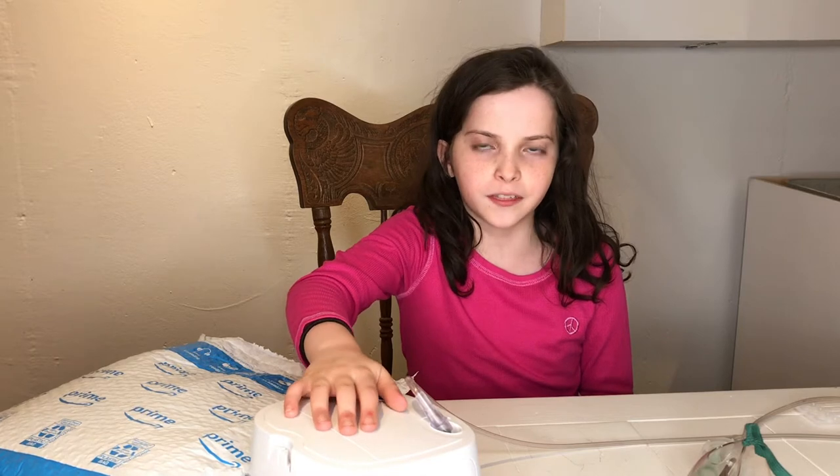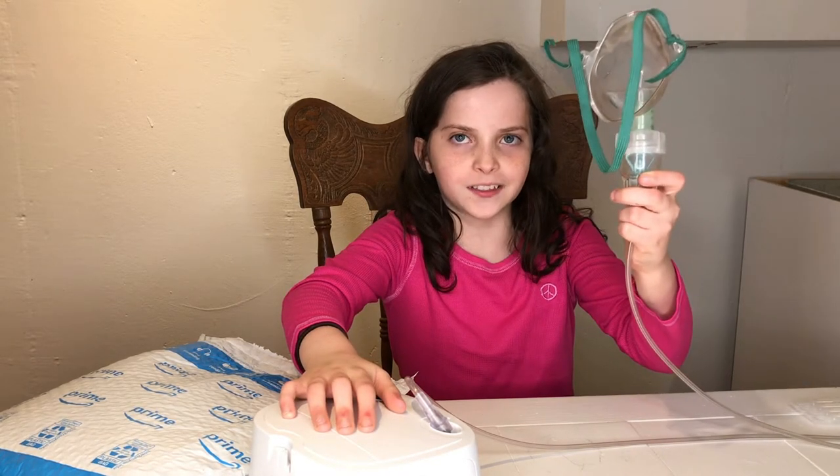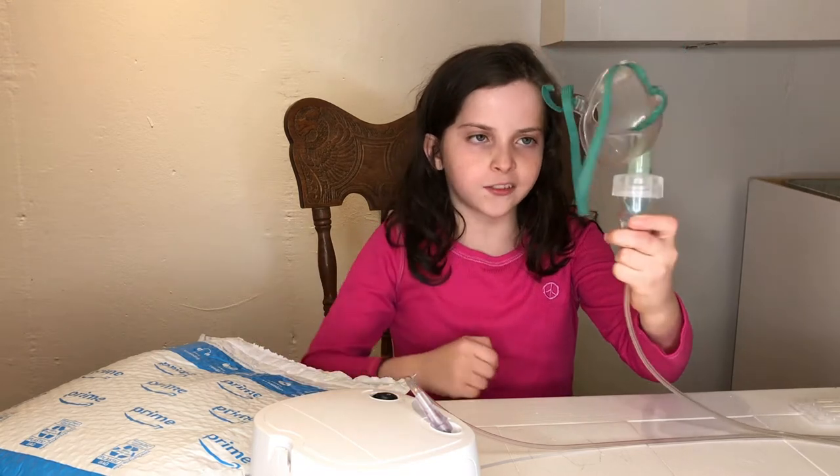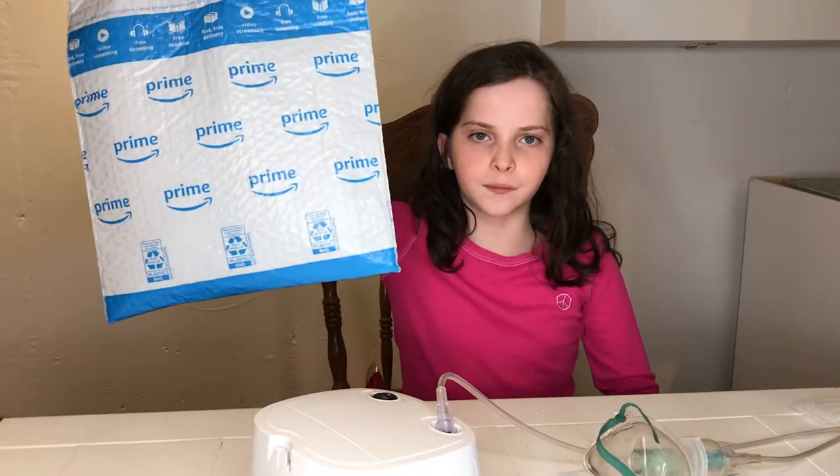I have so much asthma, so I use this machine to help me breathe. So this is an atomizer — it's very old. Today I will be reviewing this new atomizer.